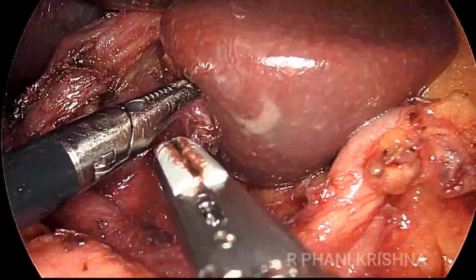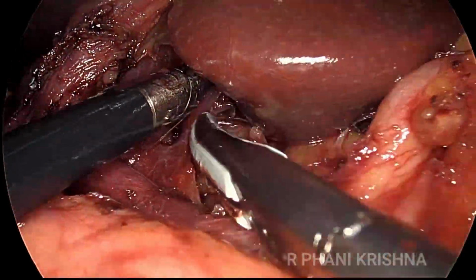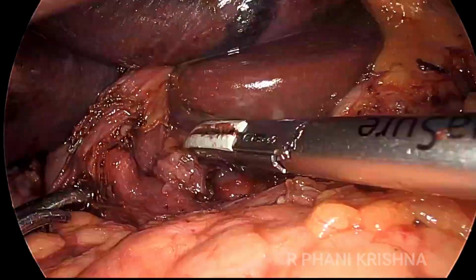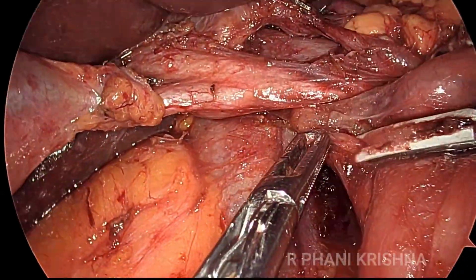And previously, where we divided the hepatoduodenal ligament chain, that is all being cleared off the portal vein. You can see all the retroportal nodes are being taken off, and then this specimen will be extracted from the right side.